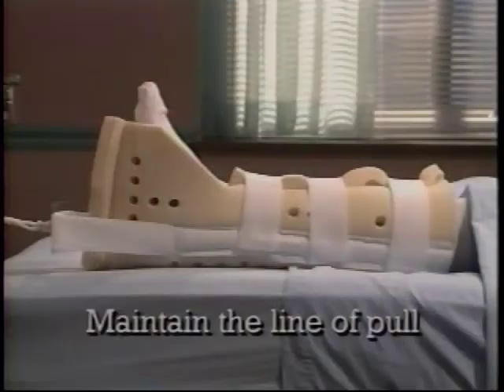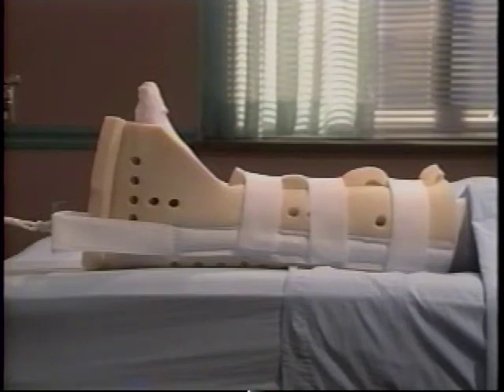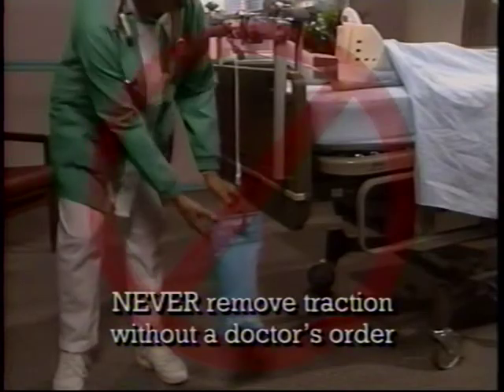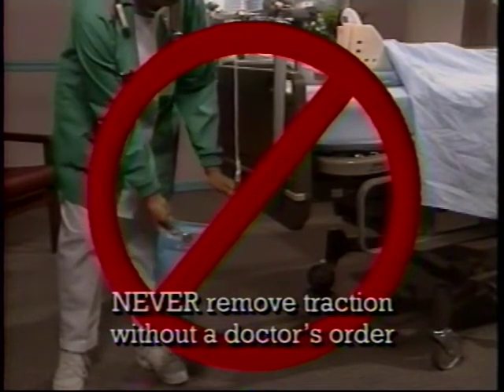It is very important to maintain the line of pull that has been established by the physician. With few exceptions, traction must be continuous. The patient should be in proper anatomical alignment. Do not remove traction or change the amount of weight without a physician's order. Patients going to the operating room are usually wheeled there in bed, in traction.